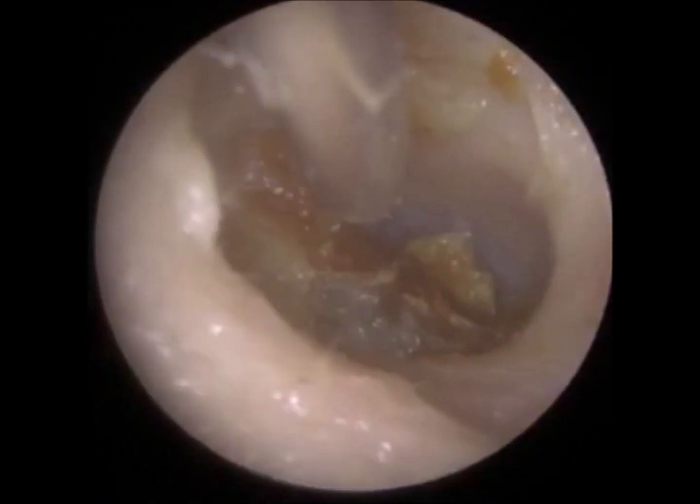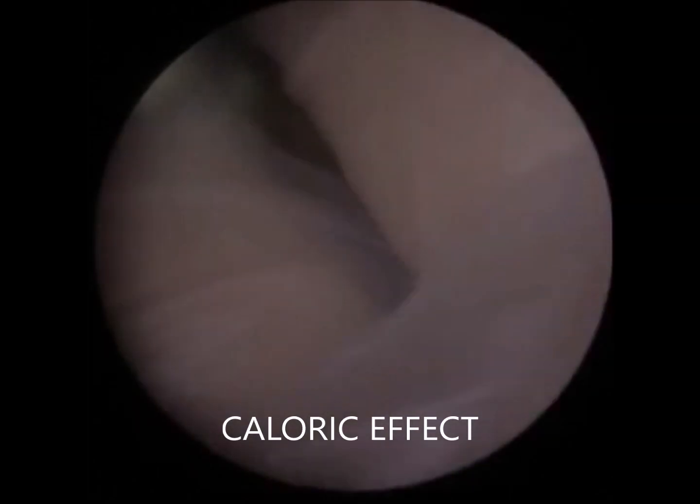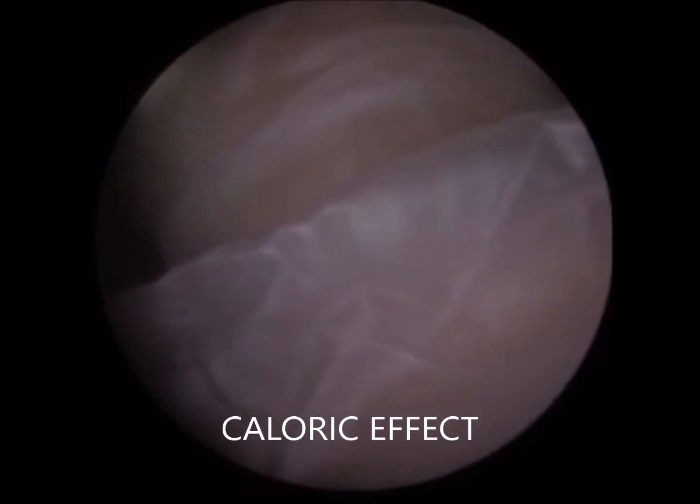That makes me feel a bit dizzy. It can do — it's called a caloric effect, so just keep your eyes open. Look straight ahead. When you're vacuuming the ear, it reduces the ear temperature, and your ears regulate your balance. So because the left ear is at a lower temperature than the right, your brain thinks you're moving, but you're not. That's awesome. So it just takes a minute and it'll settle down. It's just because we're working close to the drum — at that very point where you said you feel dizzy, I think we just got the wax off the eardrum, so it's a bit more sensitive. But it will just subside. Keep your eyes wide open, fixed on a point. What you want to do is your eyes to correct your ears and tell your brain that you're not moving, because your ears think you're moving.